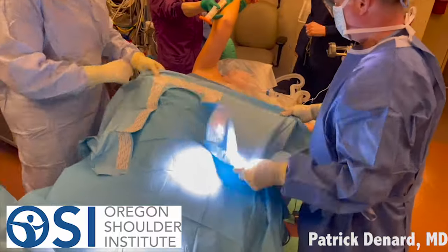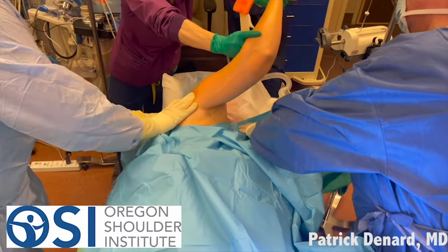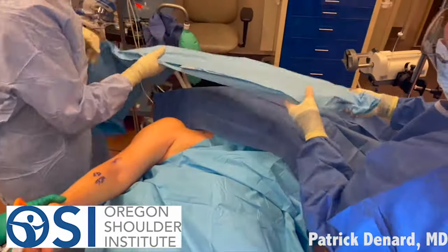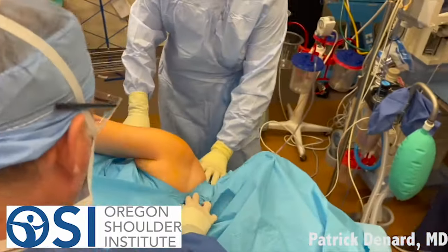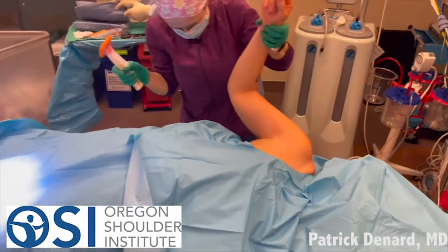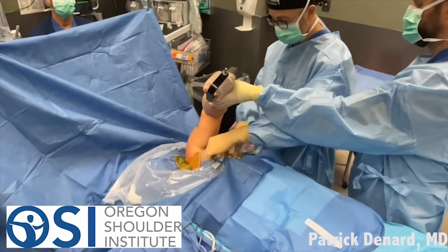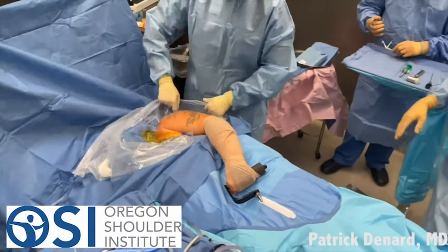Then we use a series of drapes. We put on a down sheet, and then there's a sticky U-drape that goes around the arm. We repeat this process again, putting another one over the top of the arm. Once that initial field is isolated, we shed our outer gloves. Again, we're taking every precaution we can to avoid infection. Then we'll put on the final draping, and the arm goes up in this articulated arm holder. Finally, we use these ioband sticky drapes — this helps seal the field, keeping the drapes down so they don't move as we're moving fluid through with the scope.